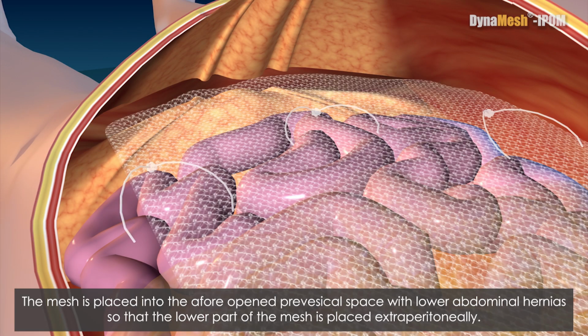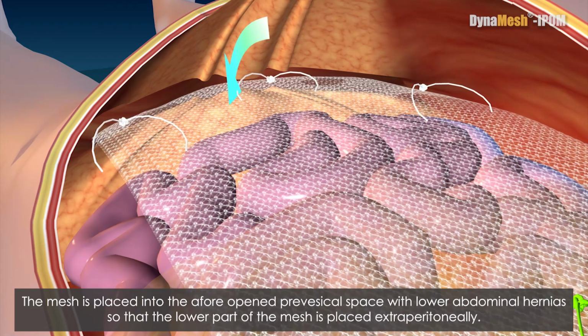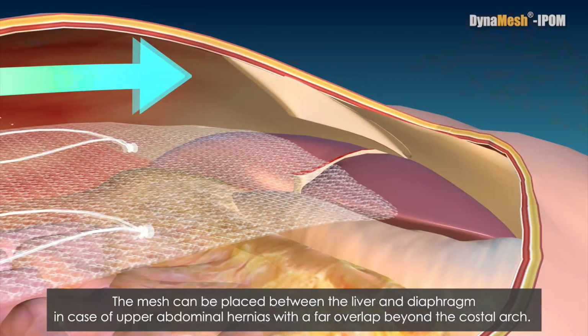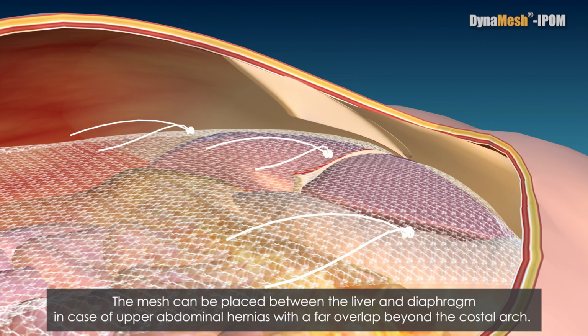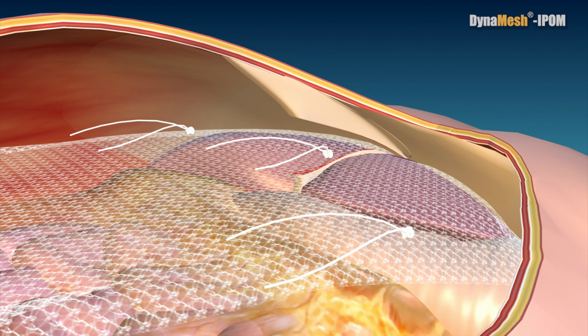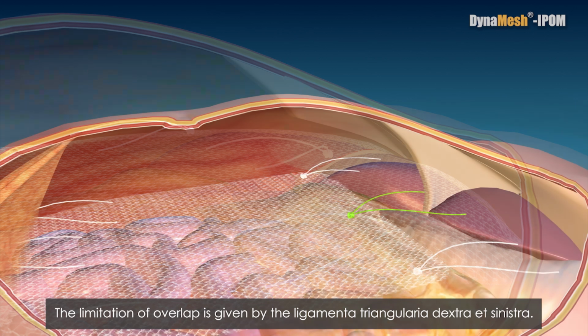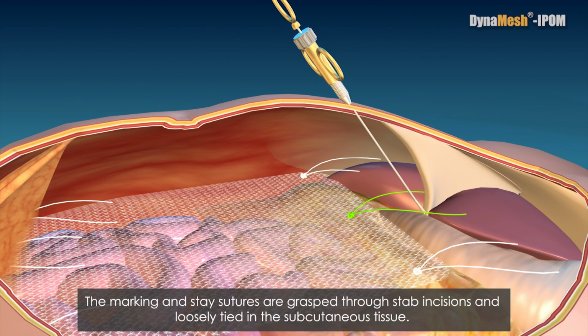The mesh is placed into the previously opened prevesical space with lower abdominal hernias so that the lower part of the mesh is placed extraperitoneally. The mesh can be placed between the liver and diaphragm in case of upper abdominal hernias with a far overlap beyond the costal arch. The limitation of overlap is given by the ligamenta triangularia dextra et sinistra. The marking and stay sutures are grasped through stab incisions and loosely tied into the subcutaneous tissue.